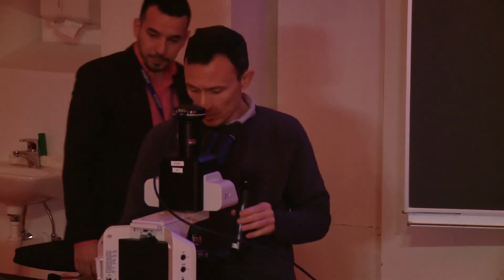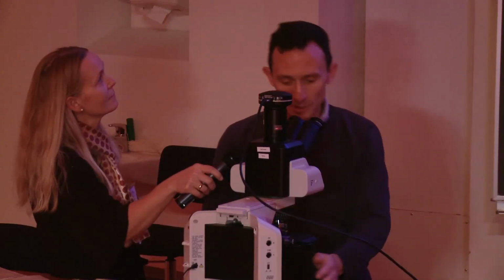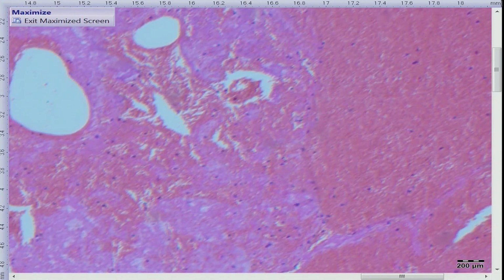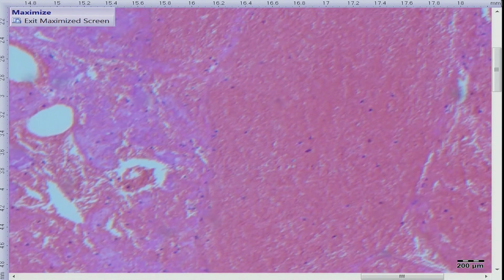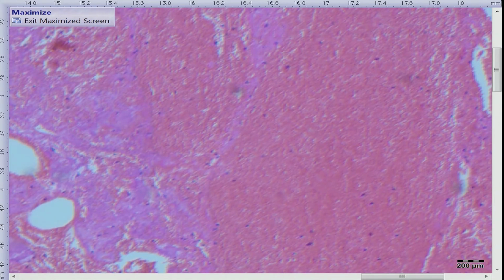First, a microbiopsy was taken from the cyst wall, and afterwards, fine needle aspirate was taken. Okay, so this is a slide showing the fine needle aspirate. It was very bloody and contained only a few cells dispersed in the blood and fibrin.